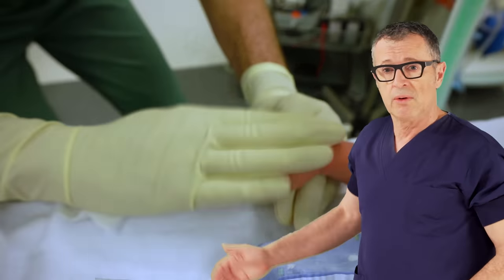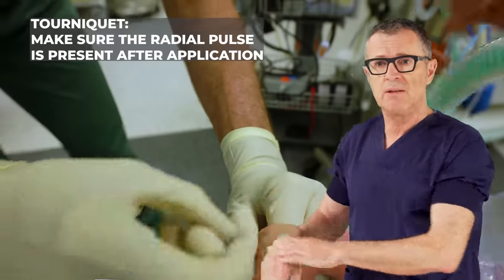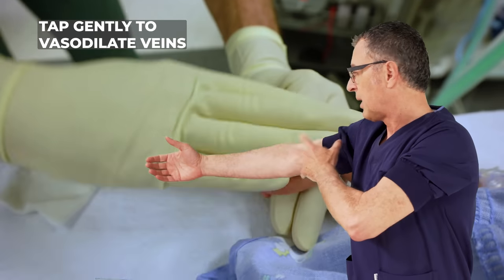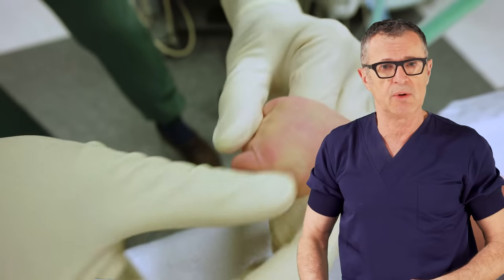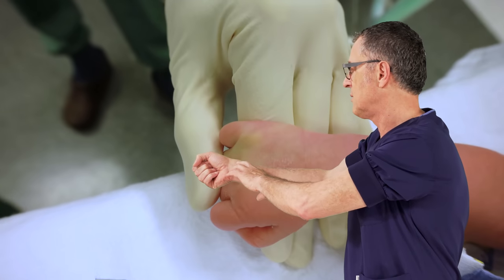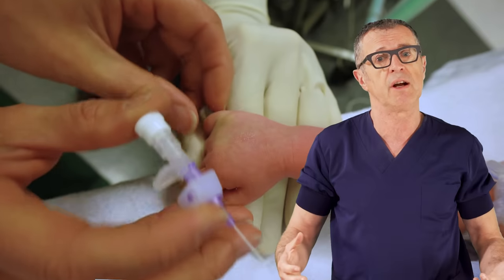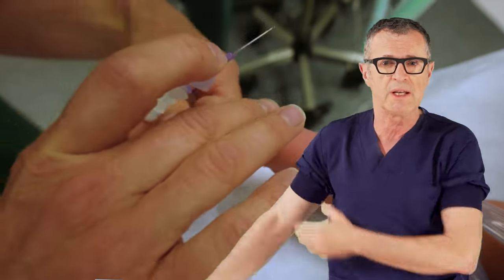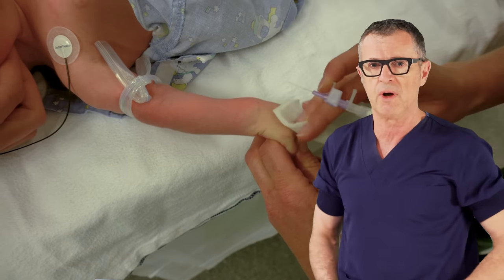Let's see how an expert inserts an IV line in the hand of an infant. We gently tap on the baby's back of the hand to vasodilate the veins. The application of the tourniquet is very important — it should be a soft tourniquet, but you must assure that the radial artery is not occluded. If the radial artery is occluded, the tourniquet pressure is too much and it needs to be released; otherwise you do not get good venous flow.